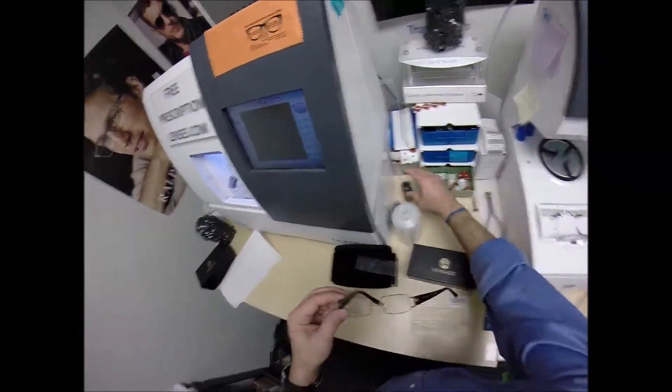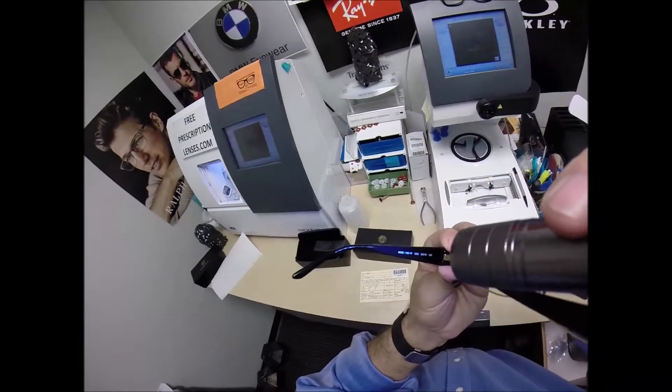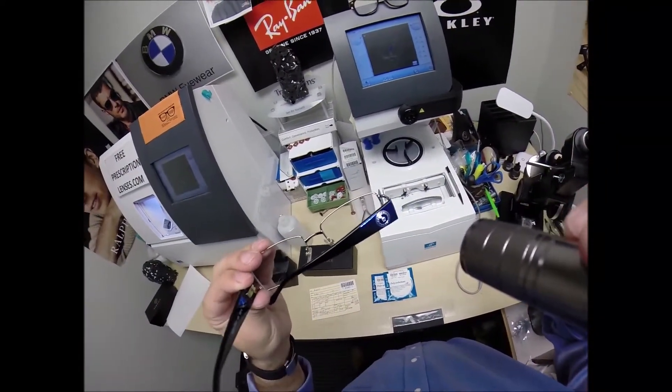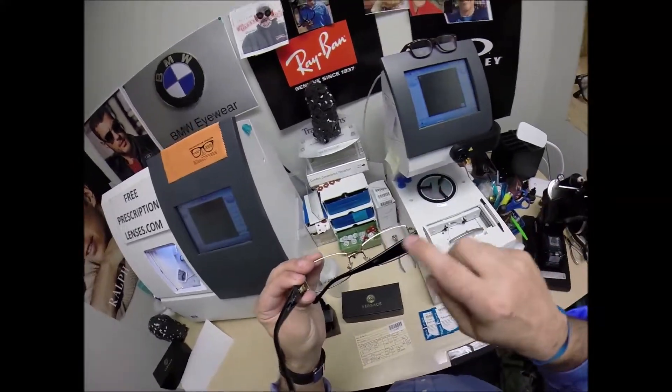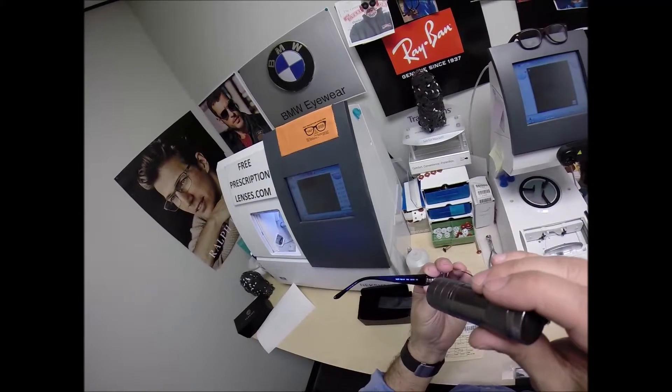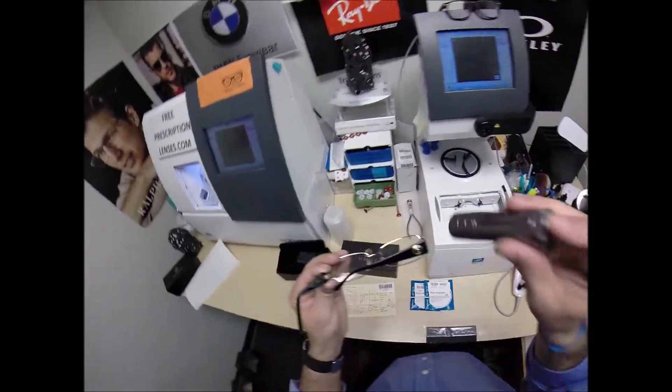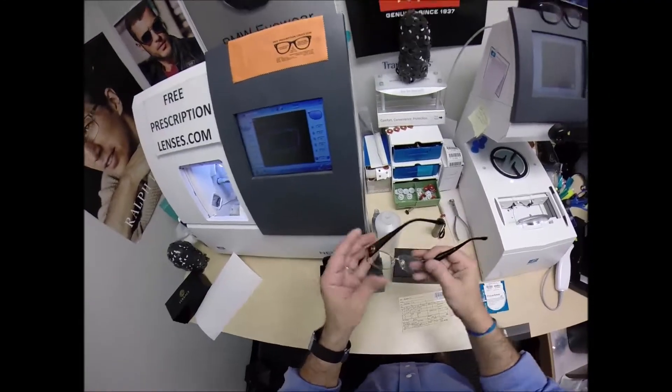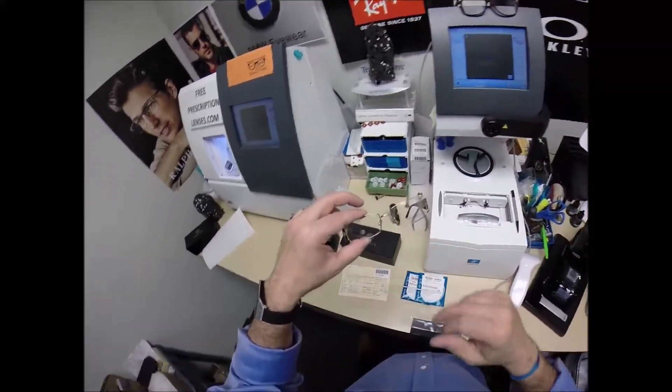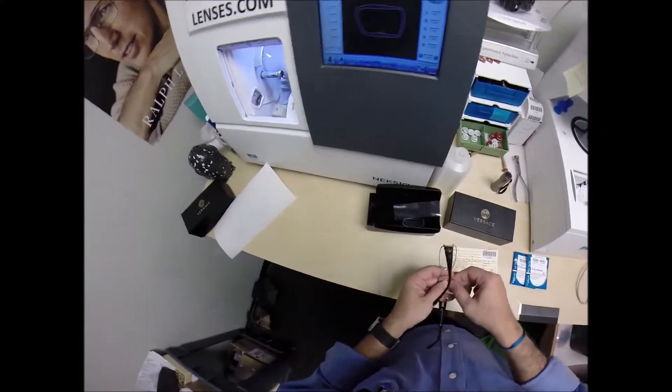This is the model number 1163M for medallion. There's also the 1163B, which has the Greco emblem all blinged out. This is M for medallion. And the color 1252, which is the pale gold and the 52 eye size. So let me begin. I'm going to pop out the original demo lenses, one of which says Versace. And of course you're going to receive all the manufacturer's original packaging.